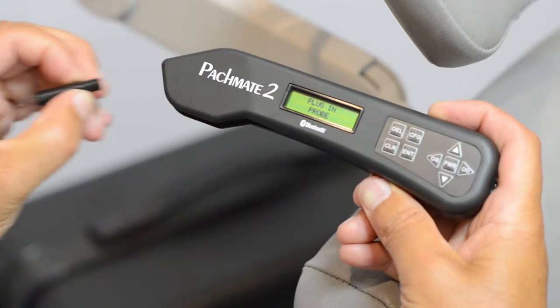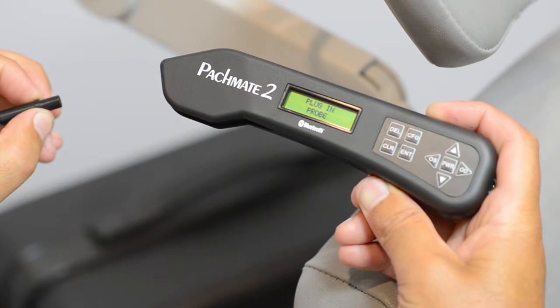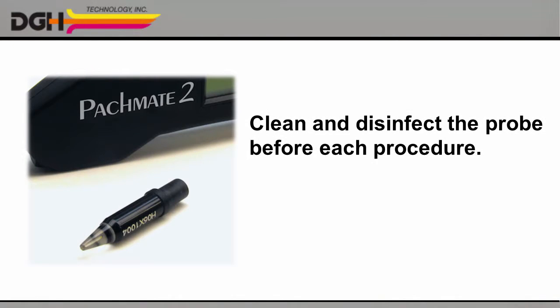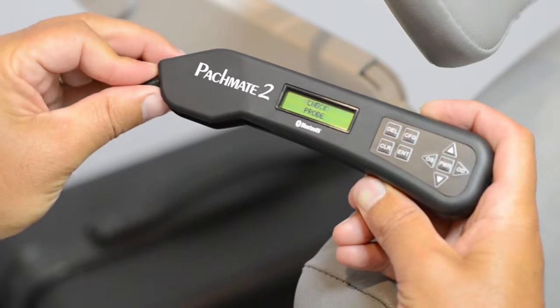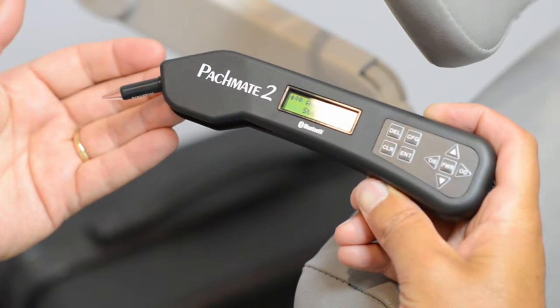You can also detach the probe entirely for cleaning. It is important to clean and disinfect the probe before each biometry procedure to avoid cross-contamination and to reduce the risk of infection. Please see the user manual for details. When you're finished, reattach the probe to the unit and make sure it's properly connected.